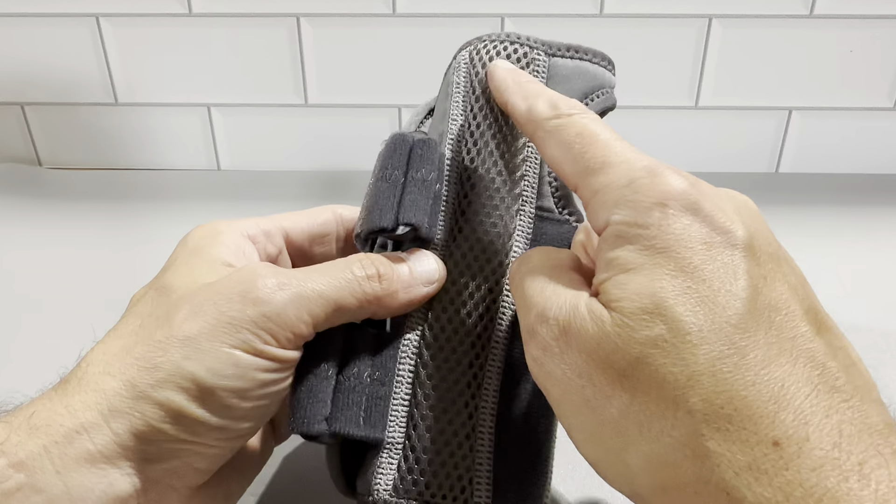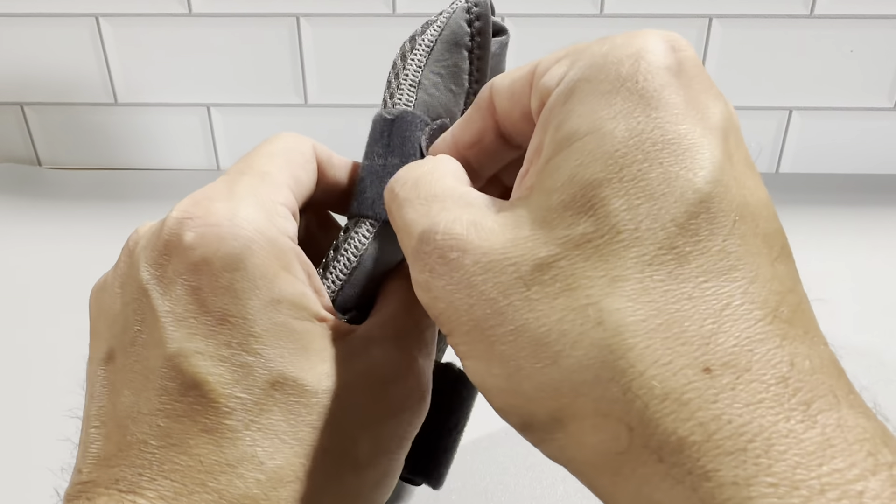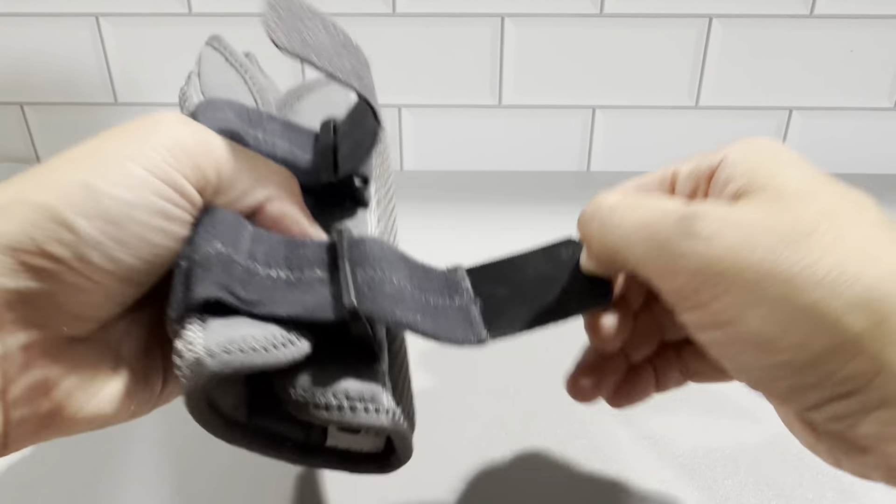It's made very well. You can see all the stitching and everything that goes into it. The velcro straps — you can see how the velcro opens and closes here. It's just very, very sturdy.